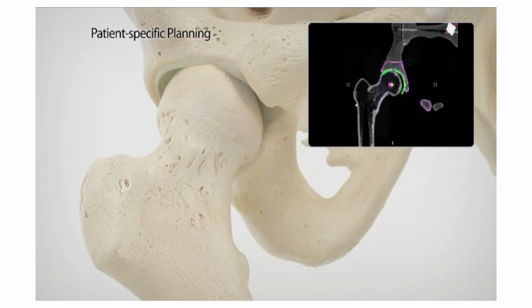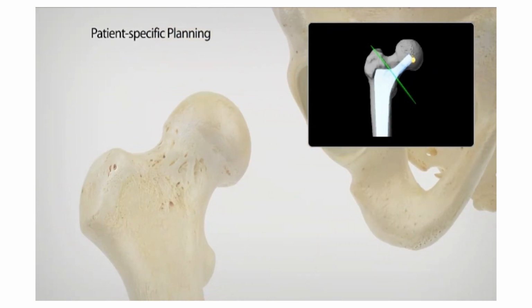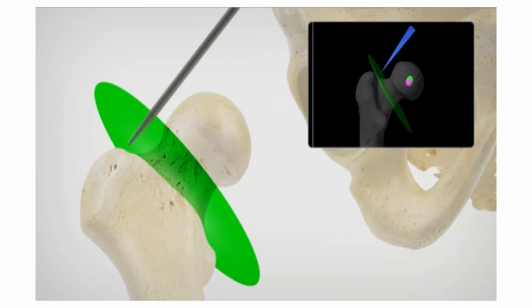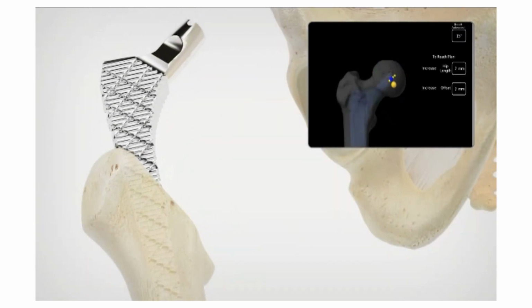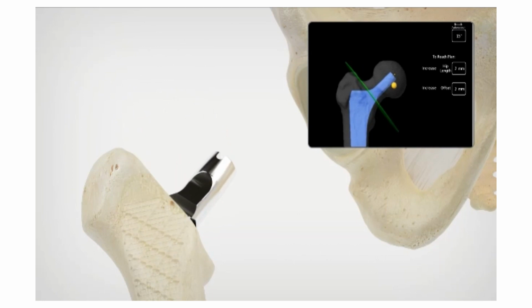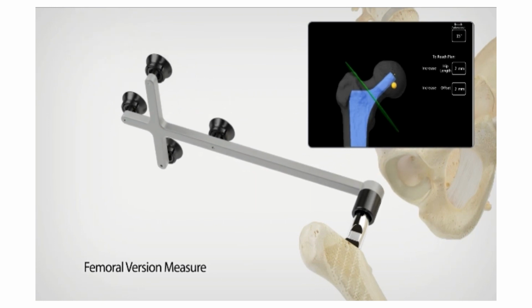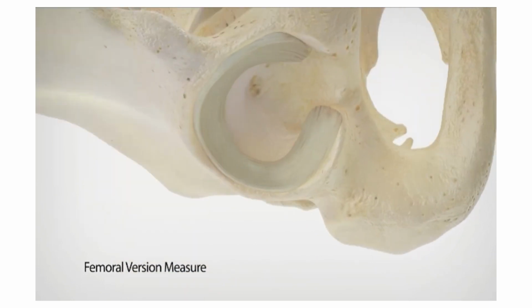During surgery, there's a process we do by patient-specific planning, but also intraoperative. We tell the robot where the bone is in space. We map out the surface of the bone and then preoperatively plan exactly how much bone to resect. Once that's done, the femoral component can be mapped out within a millimeter and degree of our plan. Again, we can check things in surgery to make sure that we have hit our target within a millimeter and a degree.